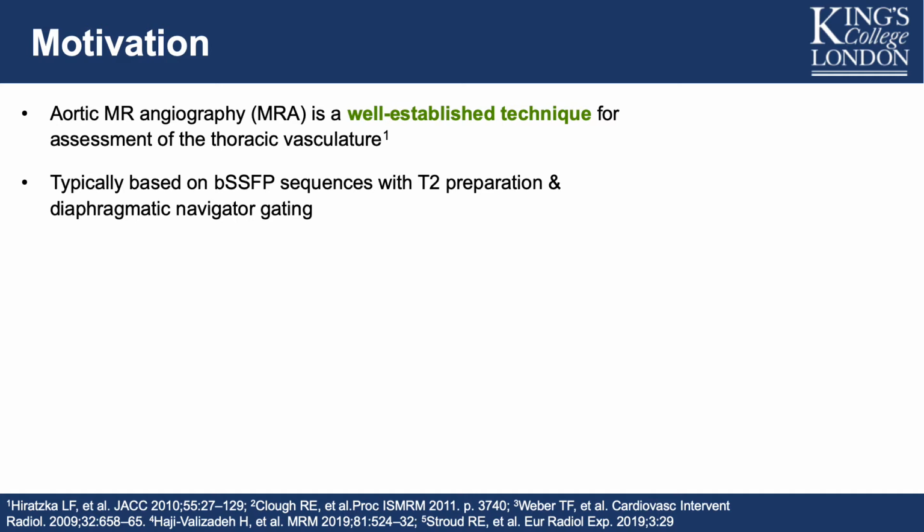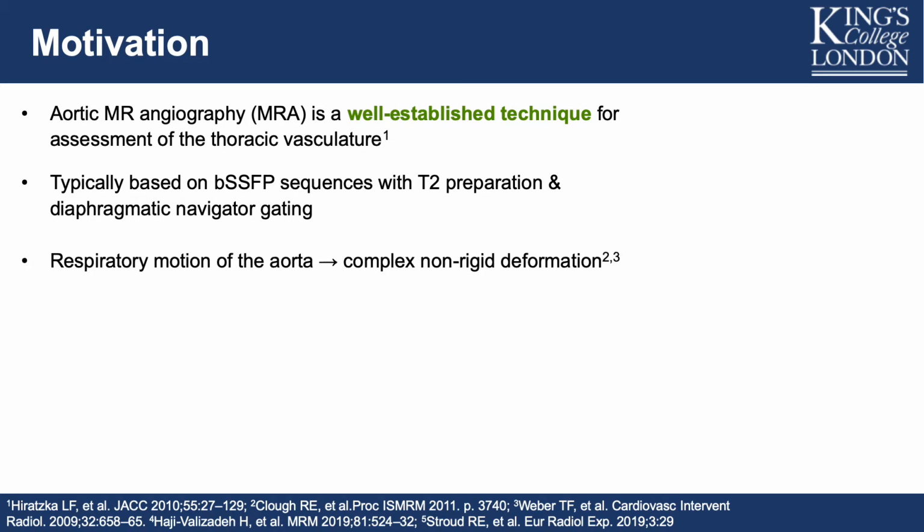Although these sequences have been around for over a decade, long and unpredictable scan times have limited their widespread adoption in the clinical routine. Furthermore, diaphragmatic navigation assumes that the respiratory motion of the aorta is rigid, but we know that the aorta moves in a complex, non-rigid fashion during free breathing, so this approach might produce suboptimal image quality.